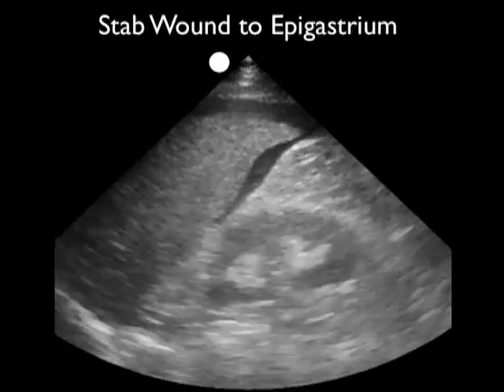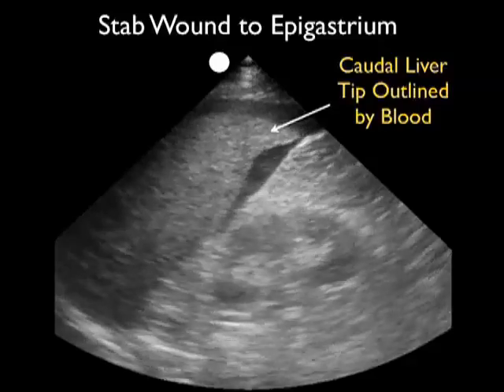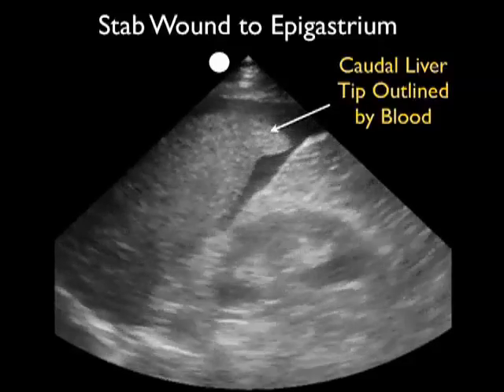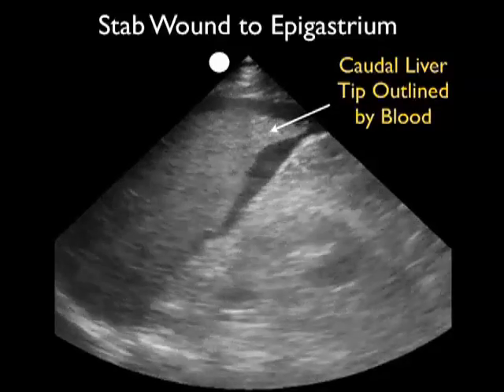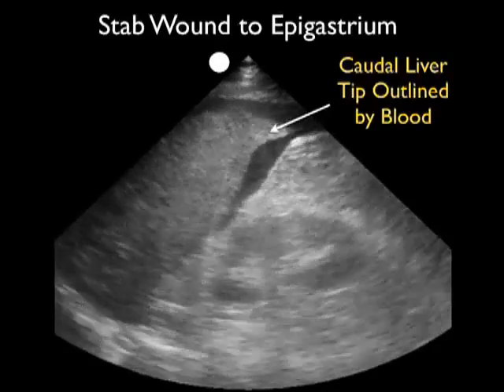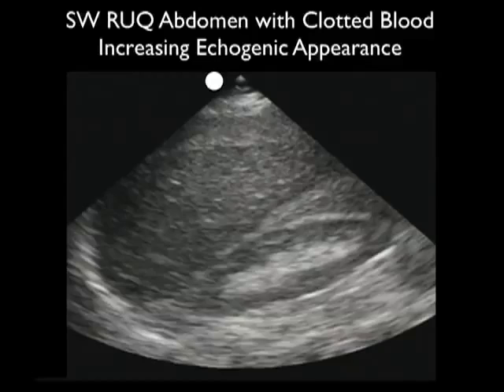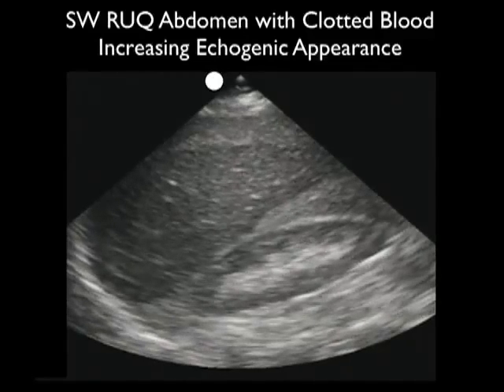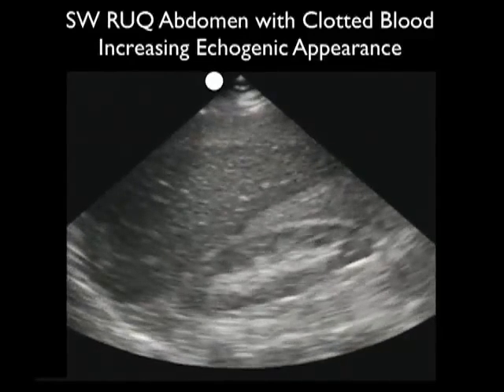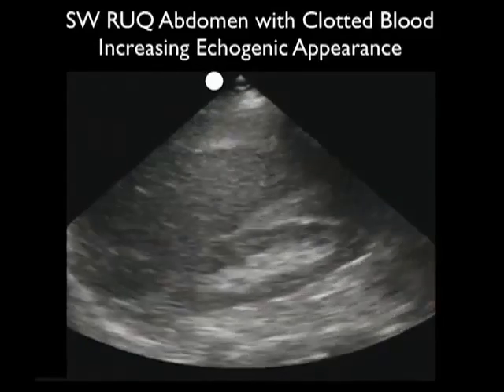And here we can actually see the caudal tip of the liver waving around in all the fresh fluid, in this case blood. And I obtained this view by moving the probe one intercostal space inferior from the last view to well delineate that caudal tip of the liver, which we can see here moving around in all the fresh fluid. In the last few video clips, the appearance of fresh fluid on bedside sonography was dark or anechoic. However, as blood clots, it can take on a more echogenic or lighter appearance.